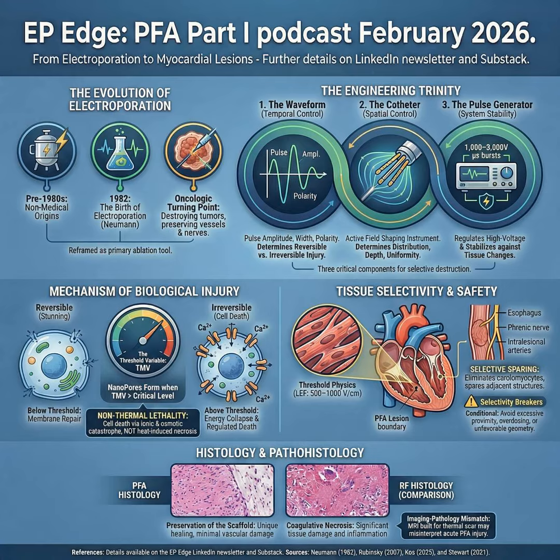Reversible electroporation isn't passive. Cells must actively restore ionic gradients, calcium homeostasis, membrane structure, and ATP supply. If repair keeps up, the cell recovers. If repair fails, permeability persists, energetics collapse, and death pathways activate. Downstream mechanisms matter: calcium influx and overload, ATP depletion, mitochondrial failure, and oxidative stress, reactive oxygen species, and lipid peroxidation, which can deepen membrane failure and lock cells into irreversible injury.